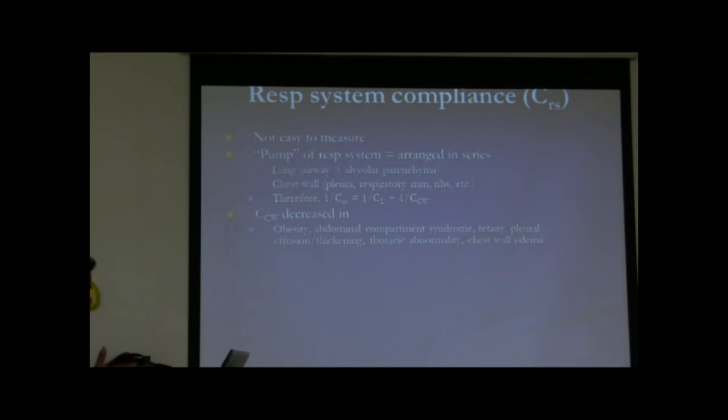It'll affect the amount of work that the ventilator has to generate to get to the alveolar pressure that you desire. How do we minimize the contribution of the chest wall compliance? Well, you can sedate or paralyze patients. You can imagine that if the patient is working against or is desynchronous with the ventilator with every breath, that's going to be a problem.